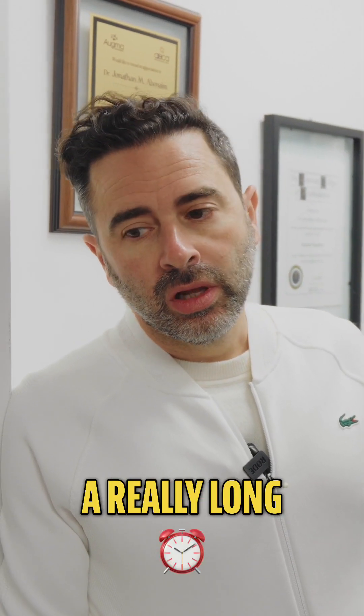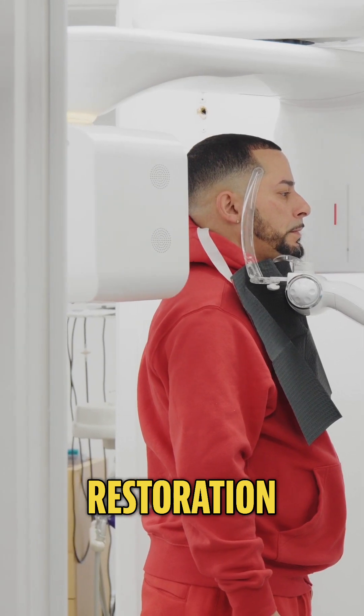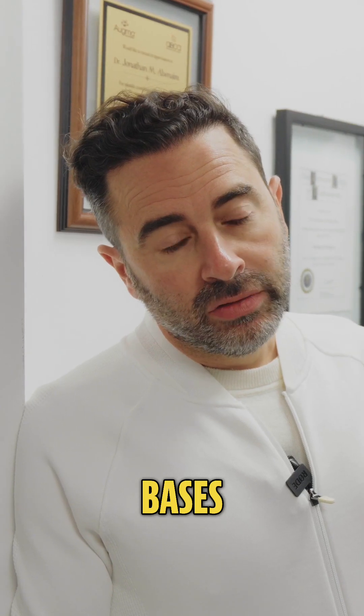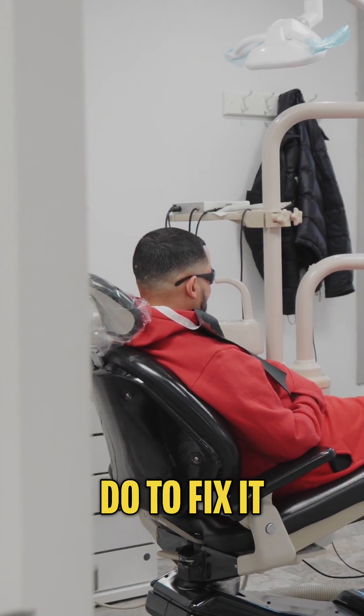We have a patient I haven't seen in a really long time. They had an older Ti-base restoration, and with all Ti-bases eventually the cement breaks and the restoration breaks. Let's see what the damage is and what we have to do to fix it.